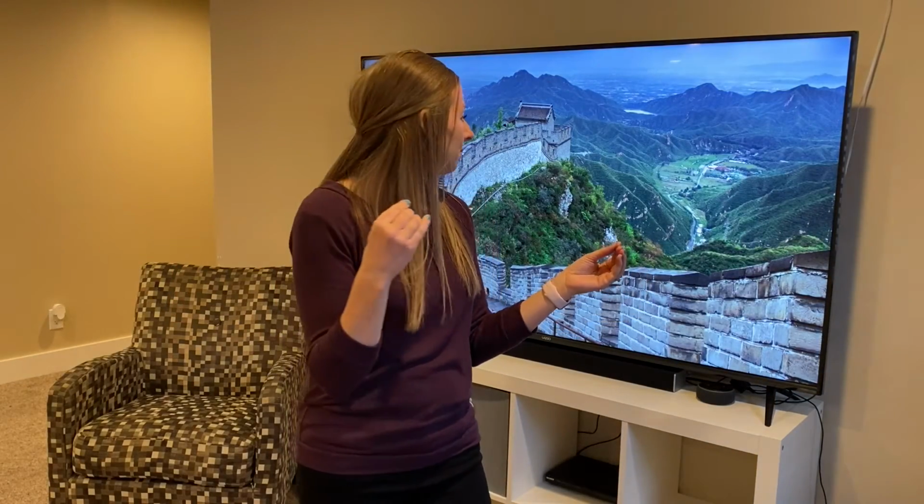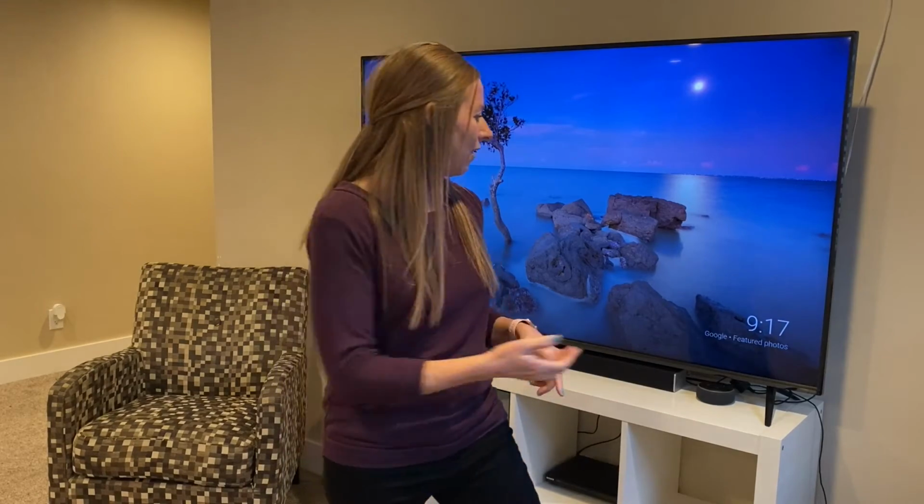Vivid Vision, it's hard to nail down an exact price. I have tried, but I call different clinics, and I have my own clinic, and the variety is huge. So the patient pays for the subscription through their office, and so it depends on how much the office wants to charge. They might charge a lot to adjust your settings and monitor everything.